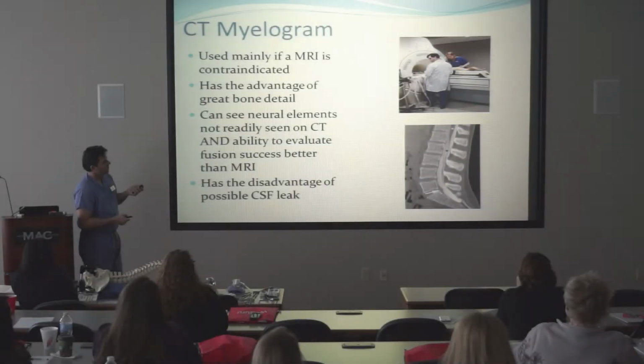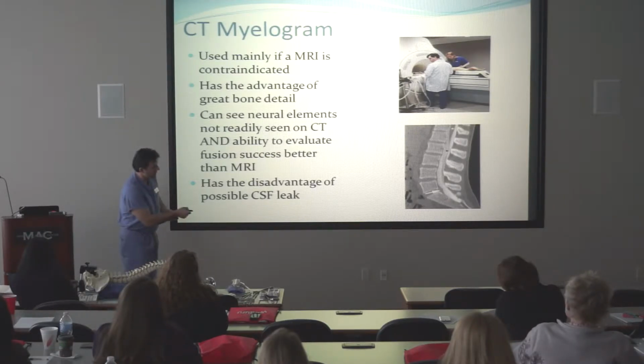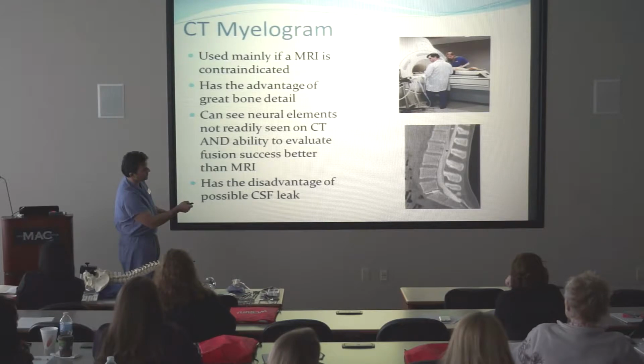All right. CT myelogram, which is basically an additional study or a procedure that's done with a CAT scan. They're basically injecting dye into that tube of fluid where the nerve roots are, okay? So it shows up on the CAT scan. So you get a little bit better picture of what the nerve roots look like in here because the dye will show up everywhere there's fluid, and where there isn't fluid, where the nerves are, you'll see structure there.